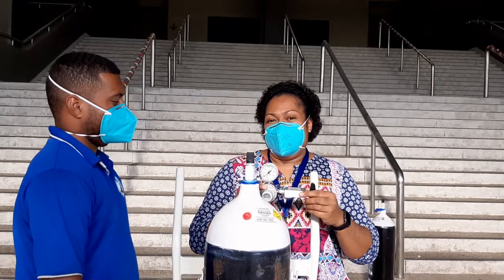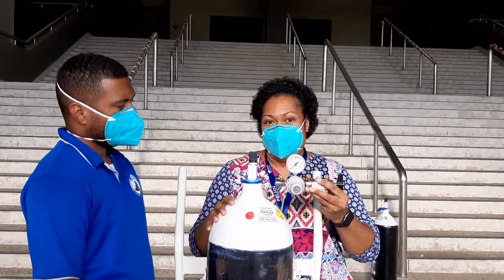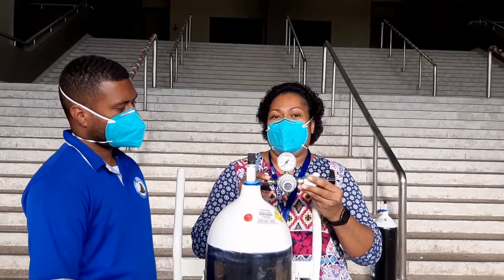You first need to ensure that you have the correct type of regulator. Given that we're using a pin index cylinder, we'll be using a pin index regulator.